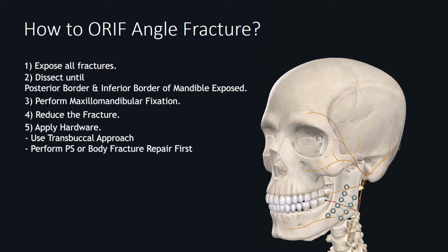Applying hardware at the angle fracture is done only after parasymphysis and the body fractures are repaired first, because angle fracture is harder to visualize and makes it more difficult to repair. Next, I'll discuss some of the surgical pearls that will increase your surgical efficiency.